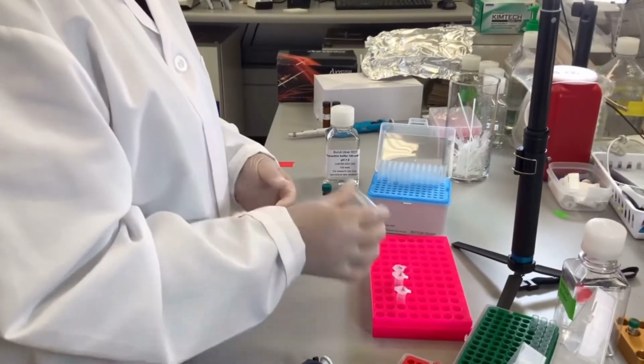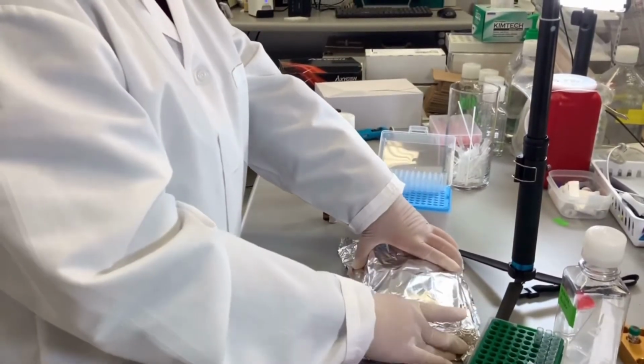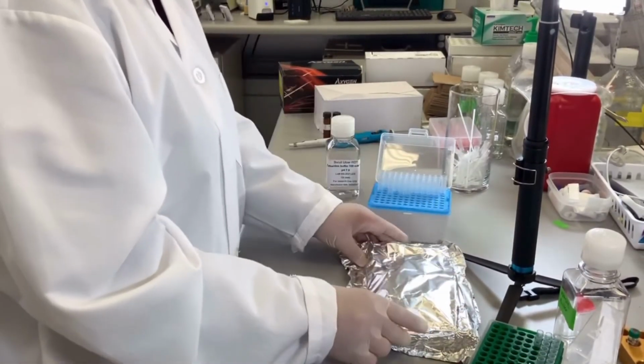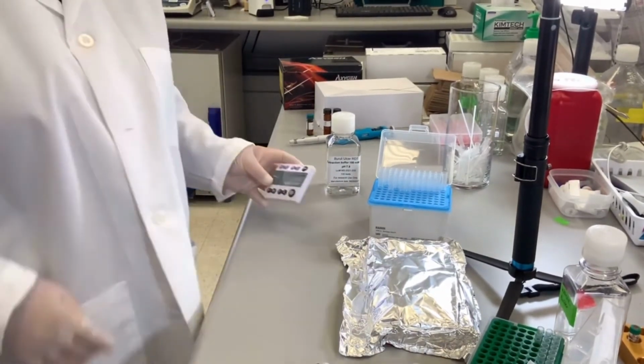Shake manually or vortex briefly. Incubate the mixtures for 30 minutes by letting them sit on a regular rack while protecting them from light with aluminum foil or a dark box. Mycolactone is light sensitive.